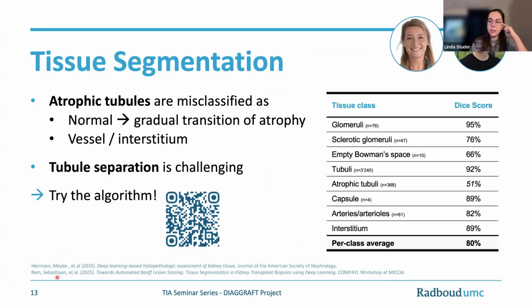That's an adaptation of SAM that came out for MICCAI 24, that is supposed to be specific for pathology. And he did find it got similar-ish results, but always a little bit subpar, especially in the borders, like really isolating the different structures. So if you're interested in that, you can have a look.